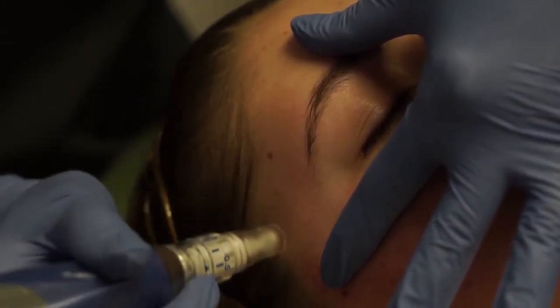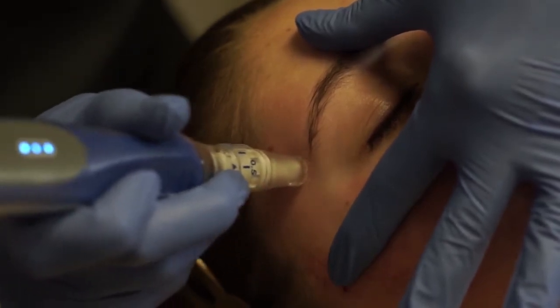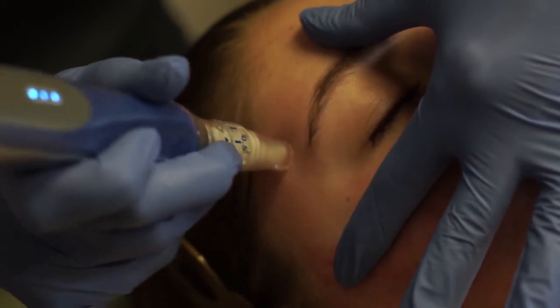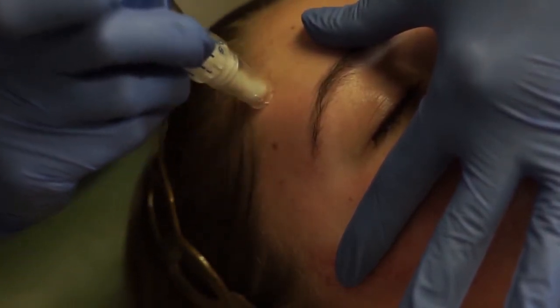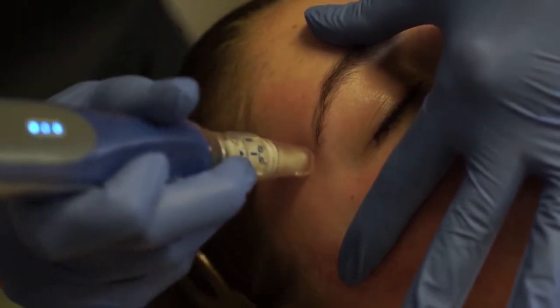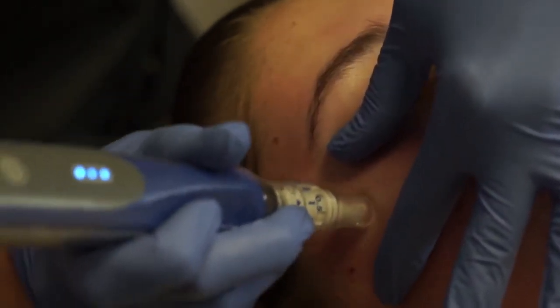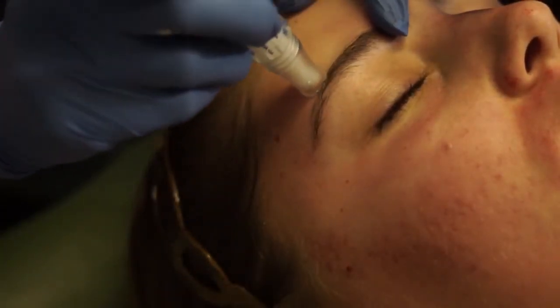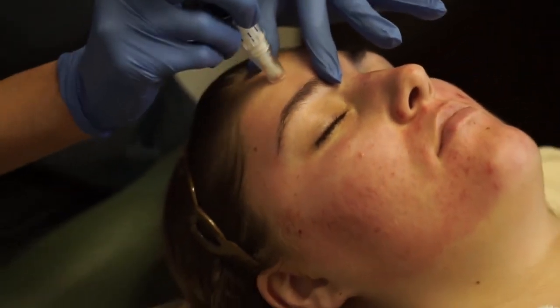According to a 2015 article published in the Aesthetic Surgery Journal, the thickness of the skin on the face can range from 0.8 millimeters up to 2 millimeters, depending on location, with the thinnest skin on the eyelids and the medial canthus, or inner corner of the eye, and the thickest skin around the nostril. For that reason, make sure to use the eyebrow as a natural border when treating the forehead and not to go beneath the brow to the delicate lid.